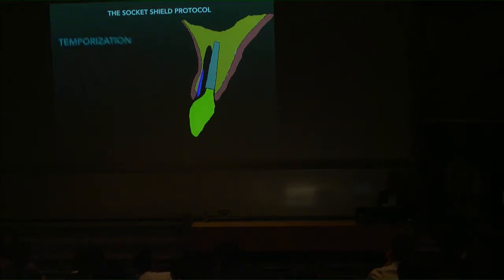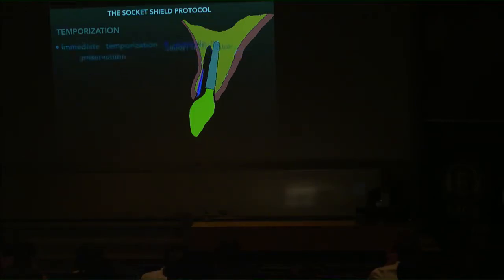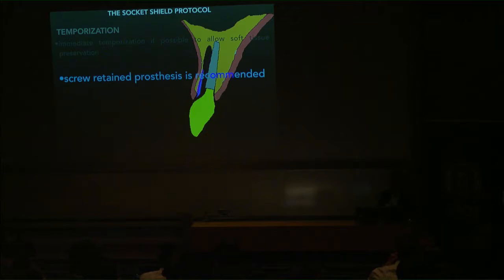Temporization. As an immediate implant, the temporary crown made at the time of implant insertion helps maintain the existing gingival contour. I plan my implant placement to have a screw-retained crown, but it's not always possible depending on the shape of the available bone.